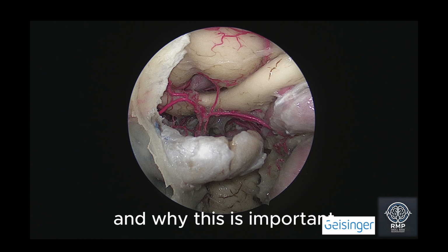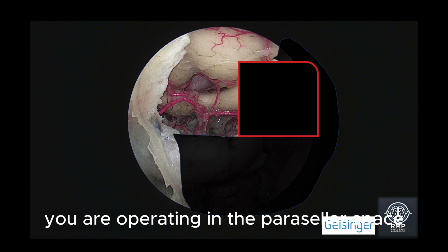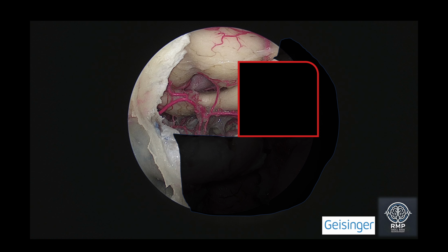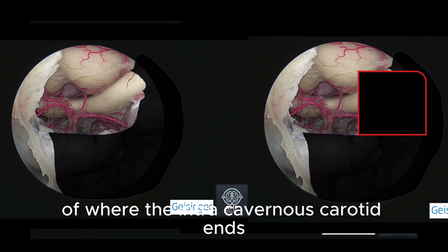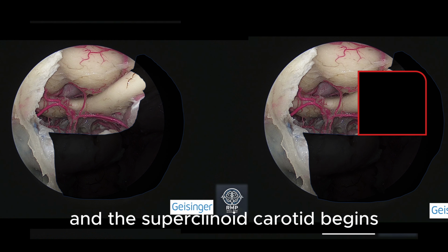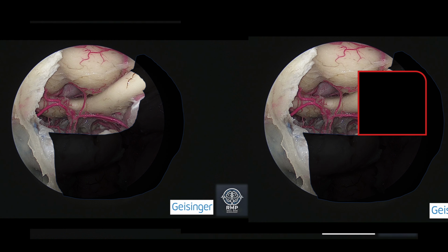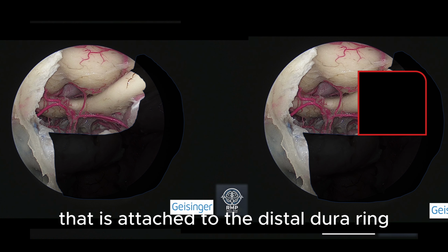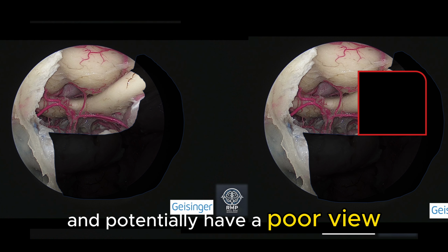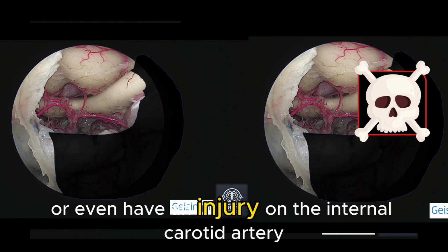And why is this important? If you don't expose this region properly, you are operating in the parasellar space without a clear understanding of where the intracavernous carotid ends and the supraclinoid carotid begins. So you might start pulling on the tumor and indirectly pulling on the carotid artery that is attached to the distal dural ring, and potentially have a poor view or even an injury to the internal carotid artery.